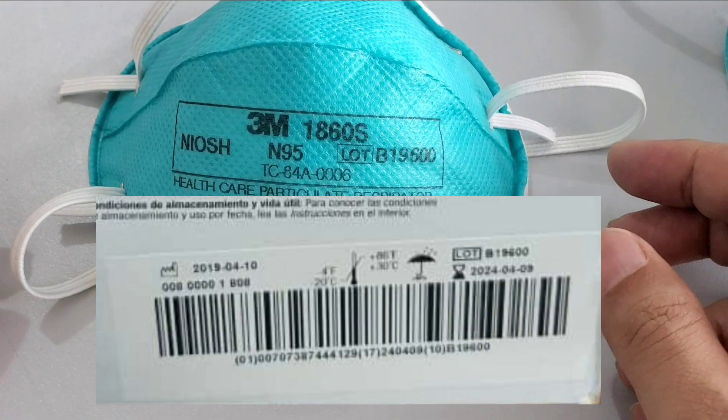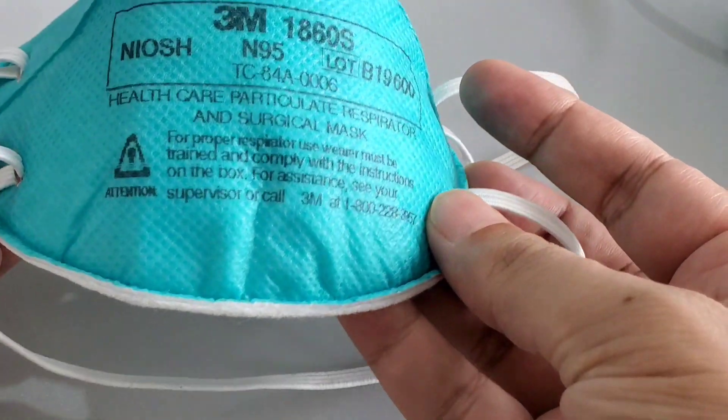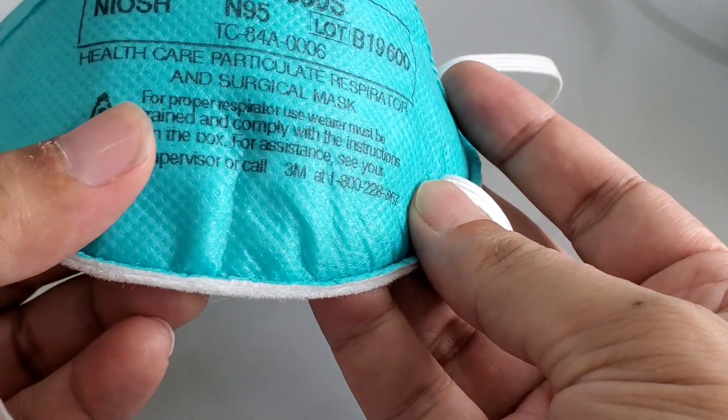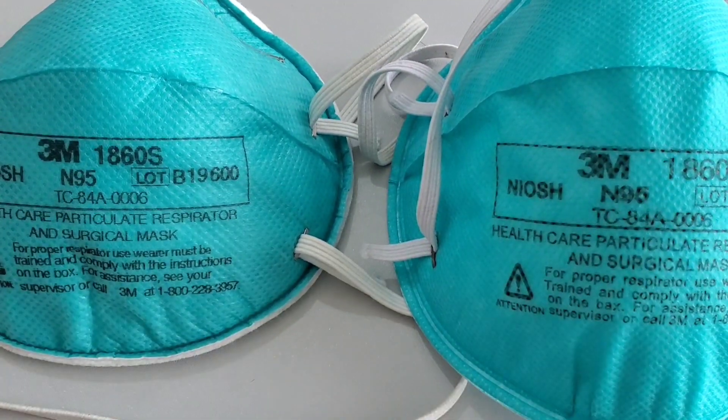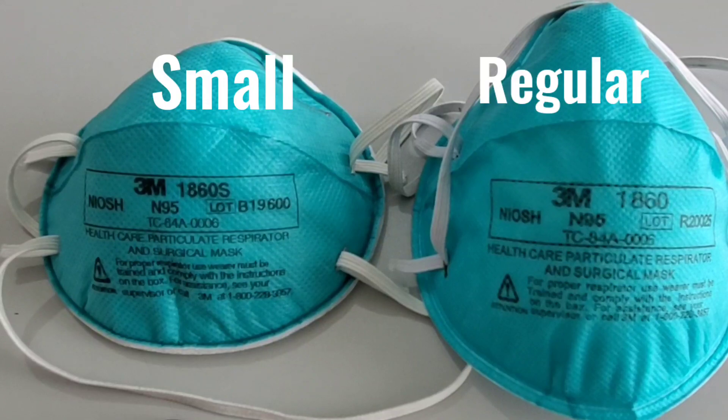Tip number three: check product validation on their website, which I have shown in my other video. It comes in two sizes — 1860S, where 'S' means small, and 1860 without 'S' is the regular size.